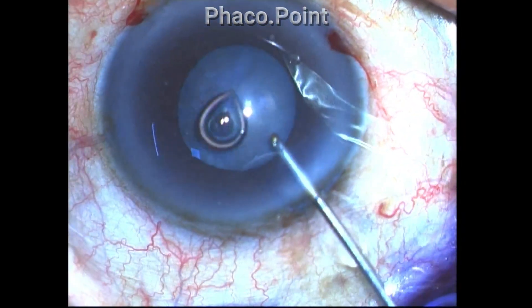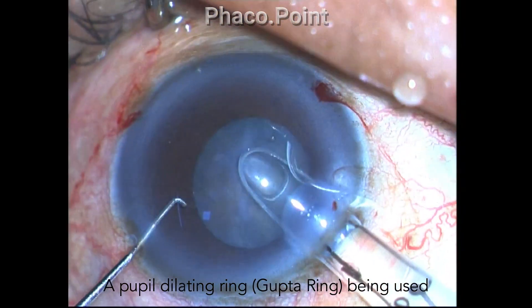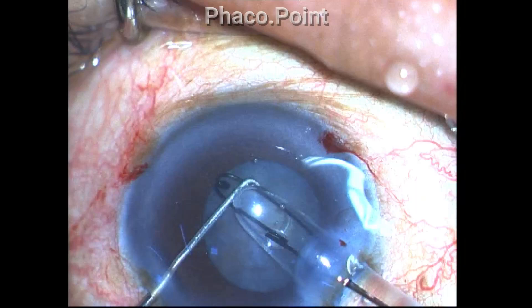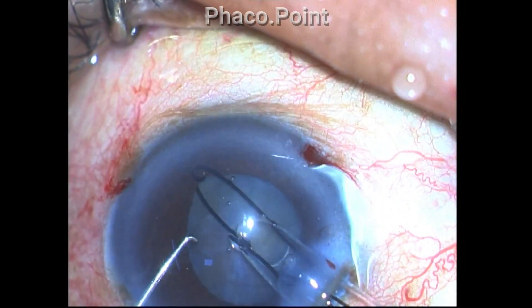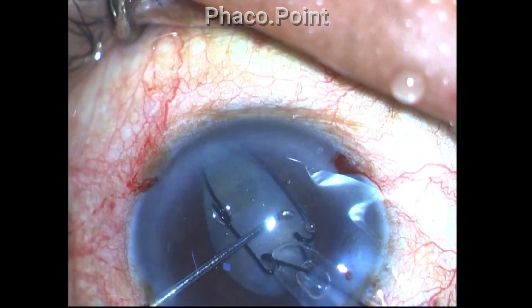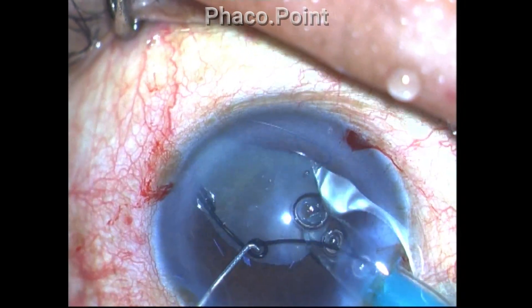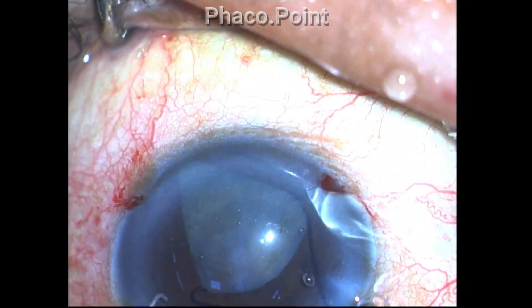A decision was then taken to implant a pupil dilating device, which is the Gupta ring. Let's observe how the Gupta ring is inserted in this case. With the help of a little nudging from the Sinski hook, it's easy to engage the three loops almost pretty consistently most of the time.